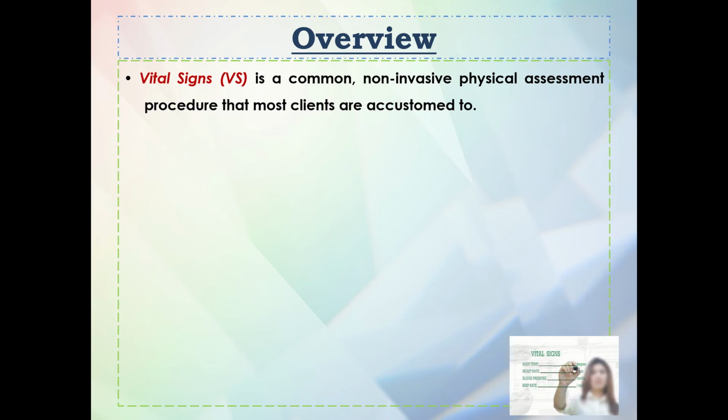So siguro naman lahat tayo as a being, 'di ba, na kapag pakuha na ng vital signs. Every time na may pupunta tayo for example sa hospital, 'di ba? A healthcare provider or healthcare professional tend to get our blood pressure. So that is one of the components of vital signs. So ito yung alam na alam ng almost all people, and this is a non-invasive procedure, meaning very simple lang siya na magawa sa ating mga pasyente.